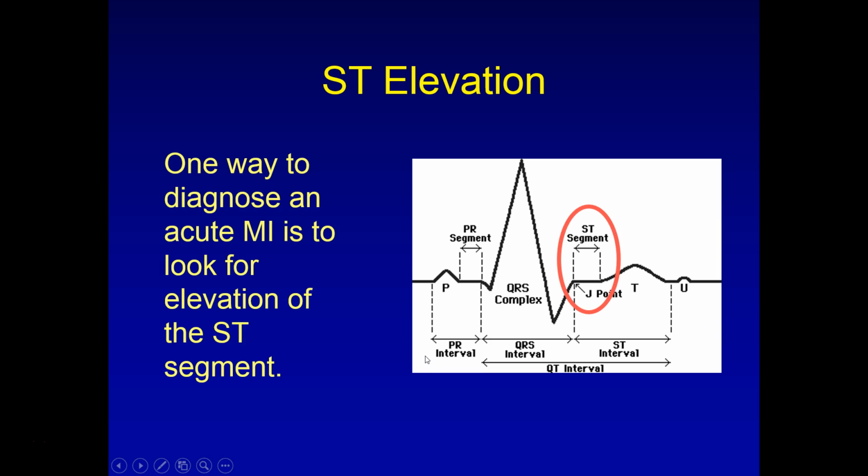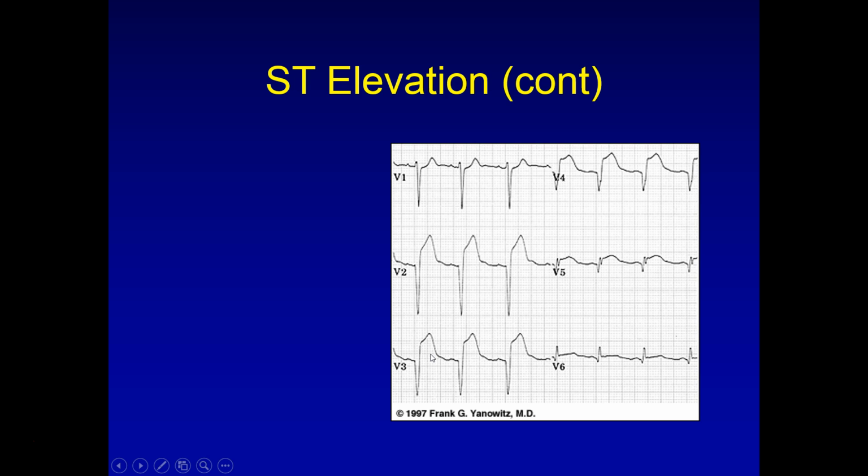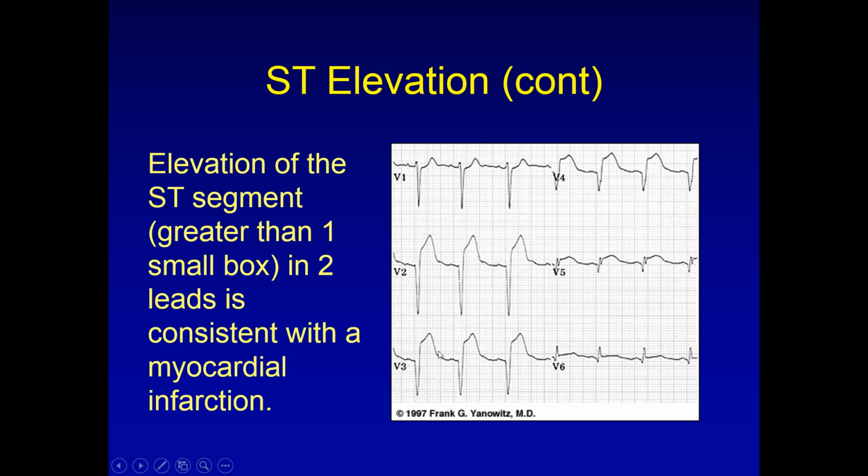Okay, let's take a look. And what you're going to look for when assessing for ST elevation is if the elevation is greater than 1 small box in 2 leads, and if so, that's consistent with an acute MI.